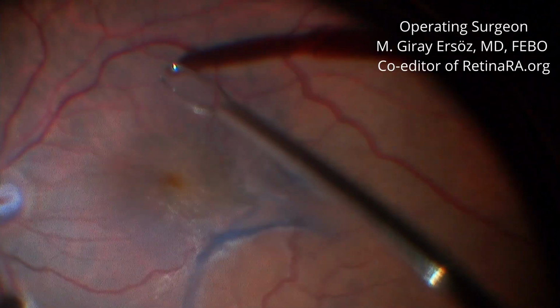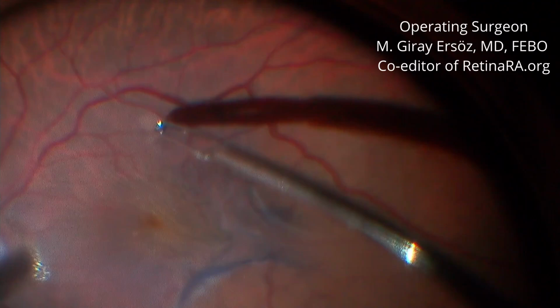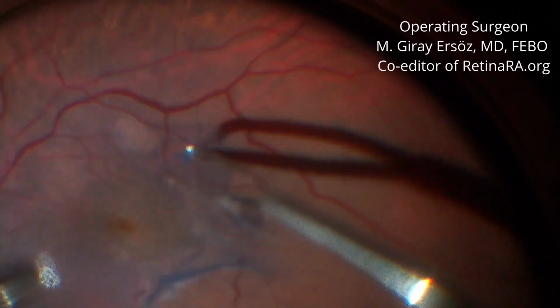A key tip for starting the peeling process. I follow the shadow of the forceps on the retina in the area where I will start peeling first. Remember that the retina is transparent and the reflex you see belongs to RPE.